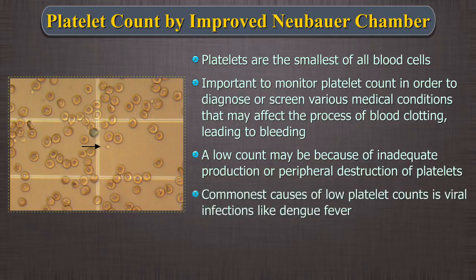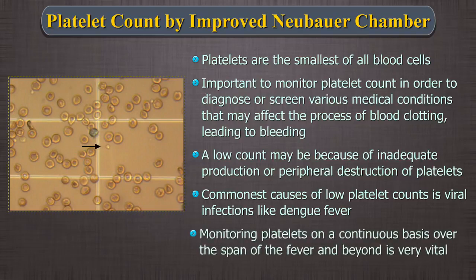One of the commonest causes of low platelet counts is viral infections like dengue fever. Monitoring platelets on a continuous basis over the span of the fever and beyond is very vital. Hence, it is important to thoroughly understand the counting process.